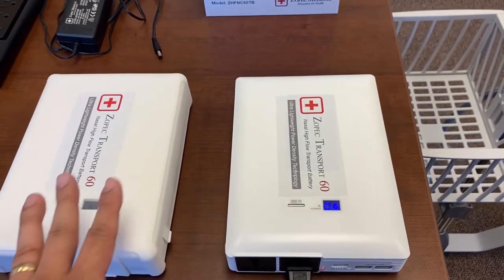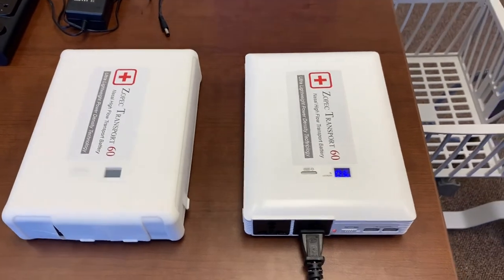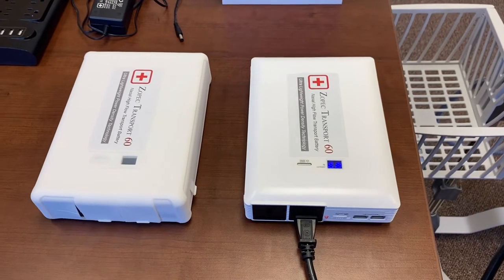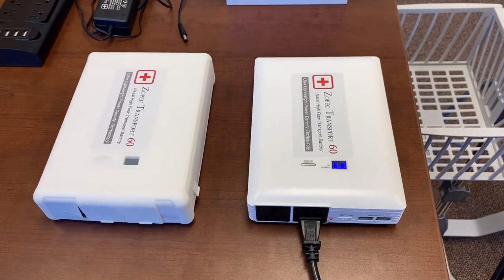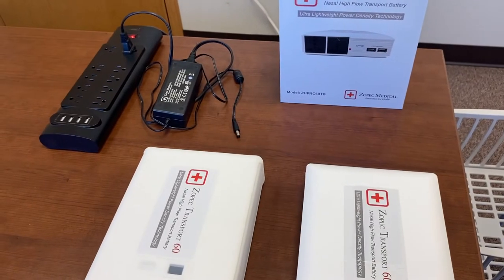You can link as many as you want — it's called our Unlimited Linking Technology. You link the batteries using the power supply that comes with the battery.